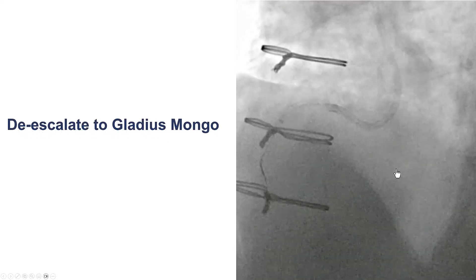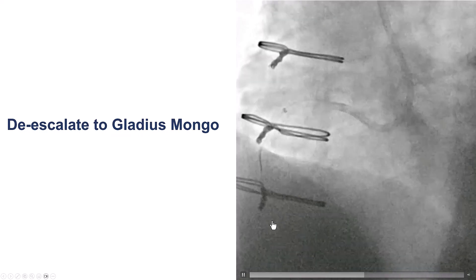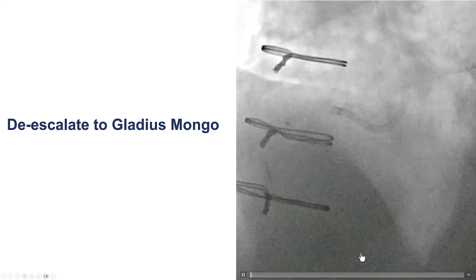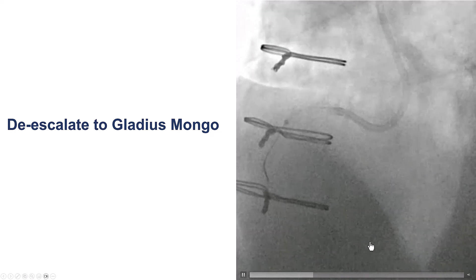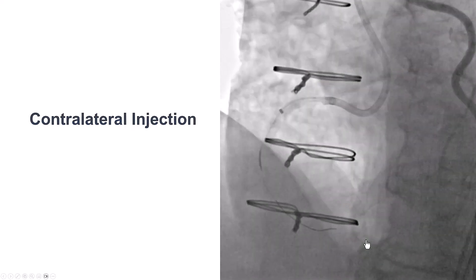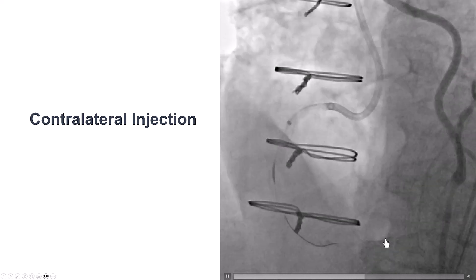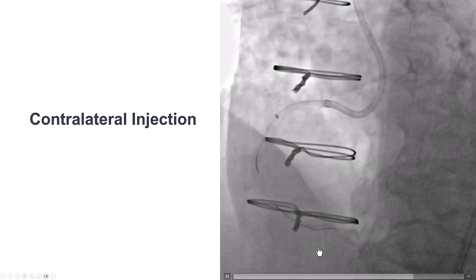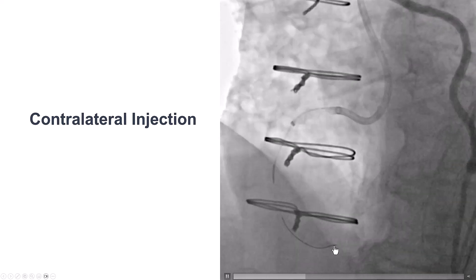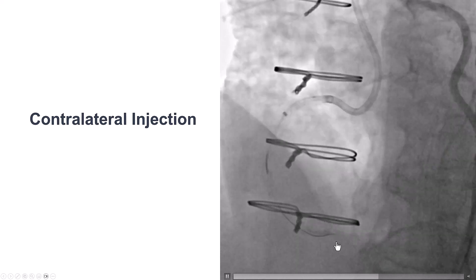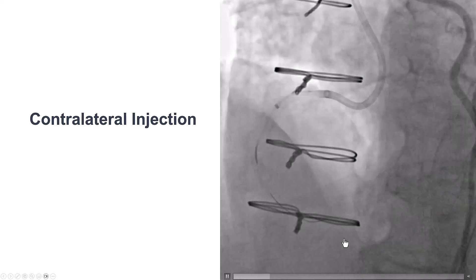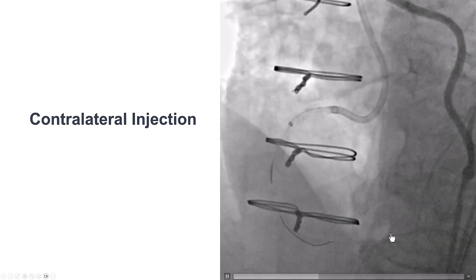We advanced the Turnpike LP, and then de-escalated to a Gladius Mongo. The plan was to use a knuckle and dissect all the way distally and do ADR, but surprisingly the Mongo seemed to go easily without being knuckled at the tip. We did a contralateral injection, and now we could see we were going in the course of the vessel and advancing the wire towards the end — a good technique for crossing CTOs once you have visualization from contralateral injection. The wire easily advanced along the course of the vessel.